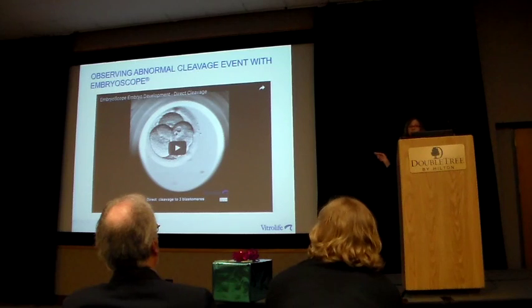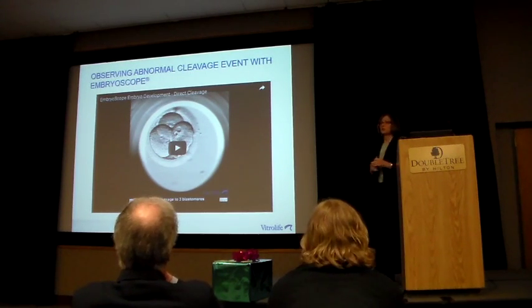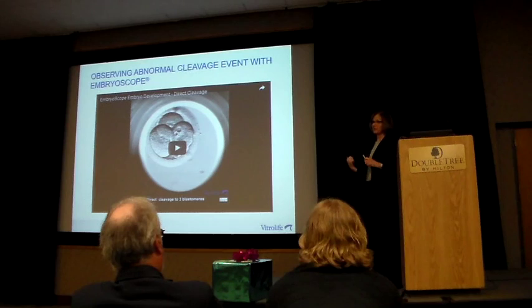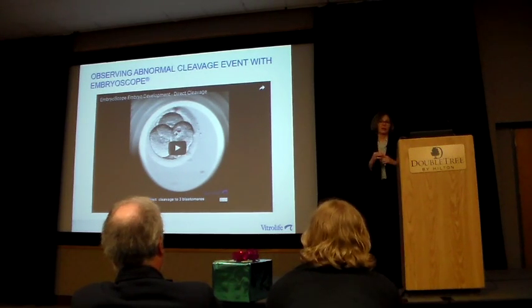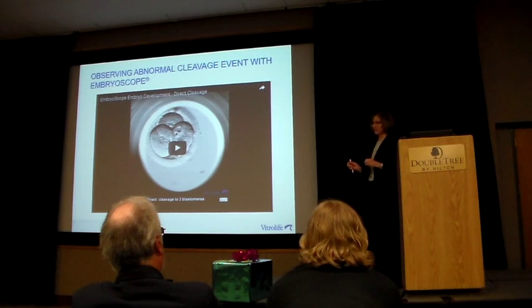So this particular type of abnormal development has been shown to significantly reduce the potential of that embryo to even create a pregnancy. Most of the studies that are out, and there are multiple, show 0 implantation with an embryo like this. The problem is it will continue to divide, and you'll keep grading it, and it might even be one of the pretty ones, but there's 0 chance of that implanting.